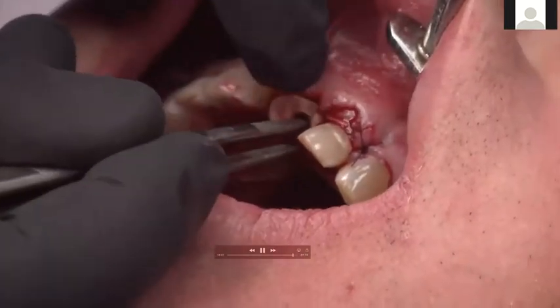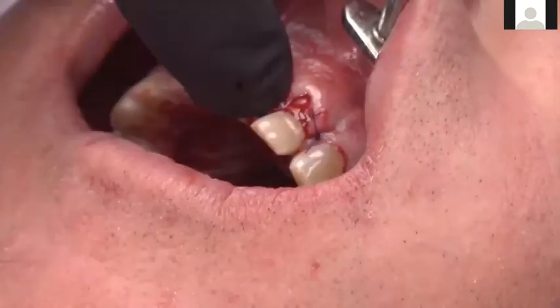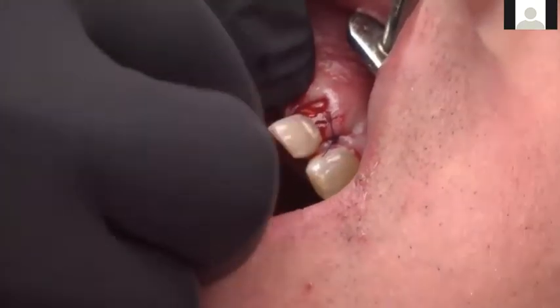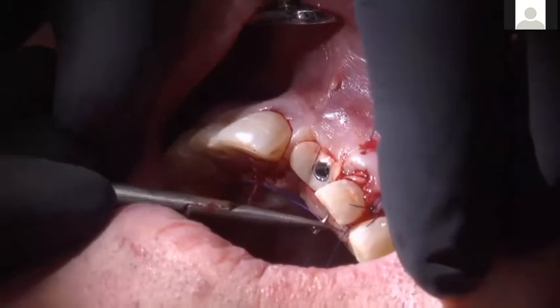So here's the custom tissue former as it goes in. This is very nicely designed by Mike. This is very easy to do. The best material to use is Enamic for this. It mills quickly, and you can mill an abutment and just cut the chimney off. After that is done, the custom tissue former is in place and is hand tightened.